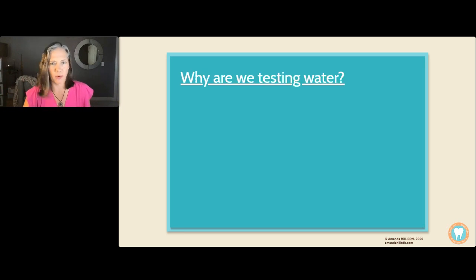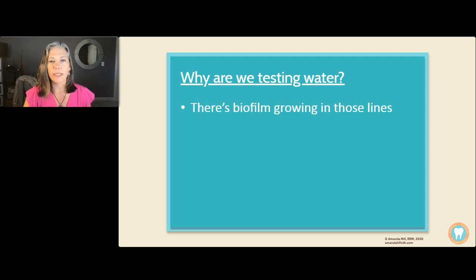So why do we test water? Why does it matter? I don't know about you guys. I've been a hygienist for over 25 years and been in the dental industry for almost 30. And I really didn't know anything about water until about 5 years ago. We are testing water because there's actually biofilm growing in those lines. Just like the biofilm in our patients' periodontal pockets, just like the biofilm that grows in different places, it is in our dental unit water lines. And that biofilm can actually affect our patients' health. So it's really important that we make sure we're keeping these things clean and safe.